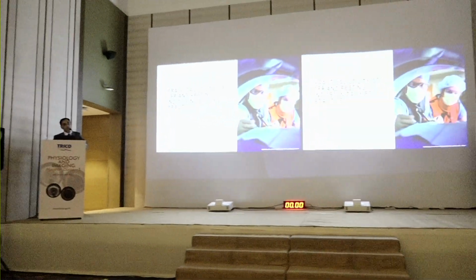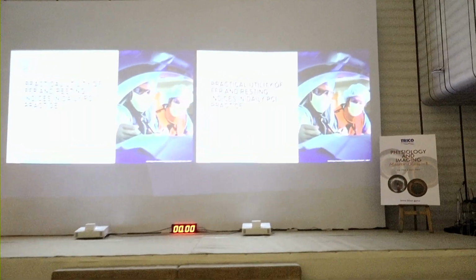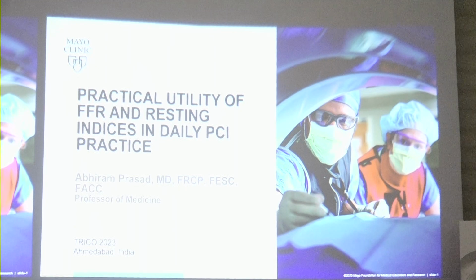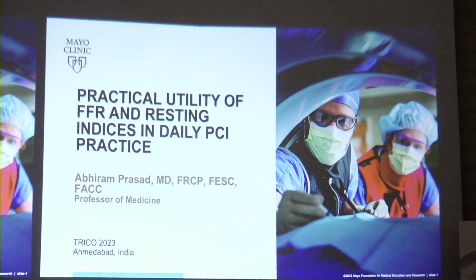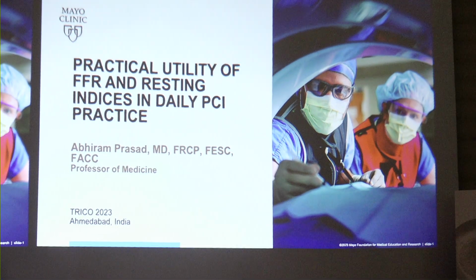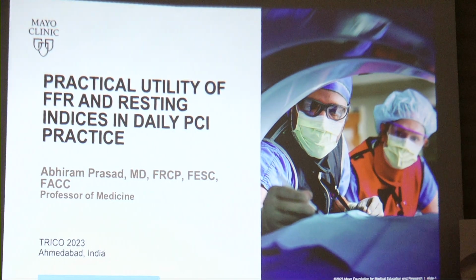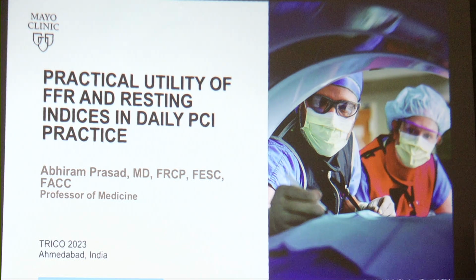Thank you, Tejas. It's really a good pleasure to be here. What I wanted to do was change gears a little bit. Many of the young faculty probably are not even familiar with the trials that made the foundation of FFR, because this technology has been around for a very long time, so much so that we just accept it for what it is.